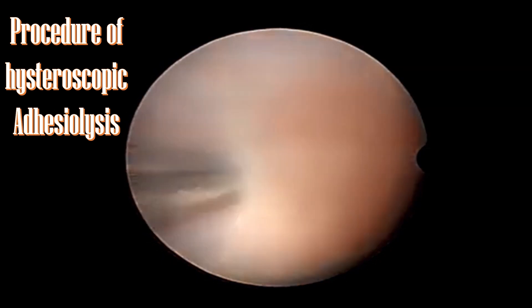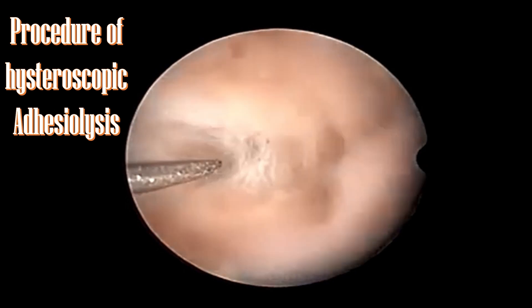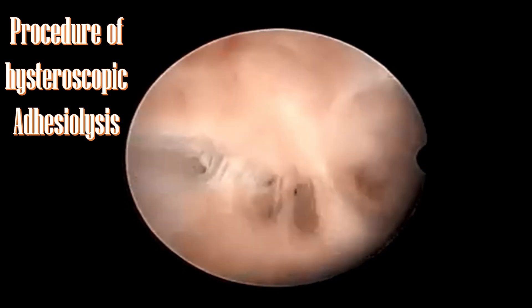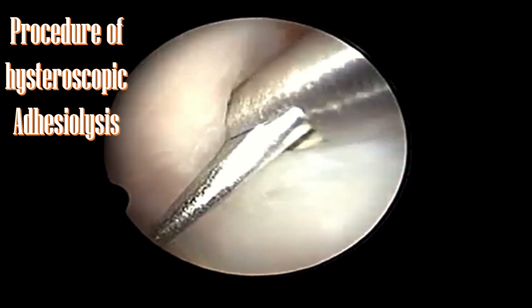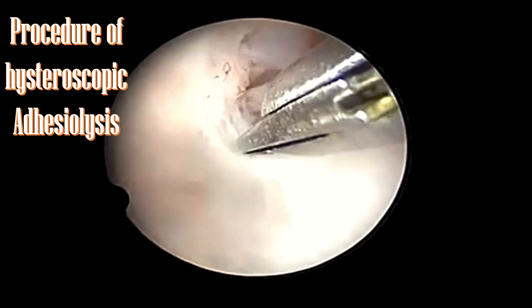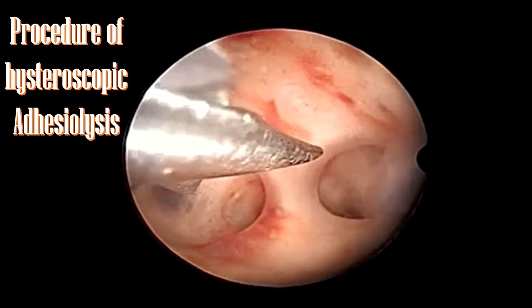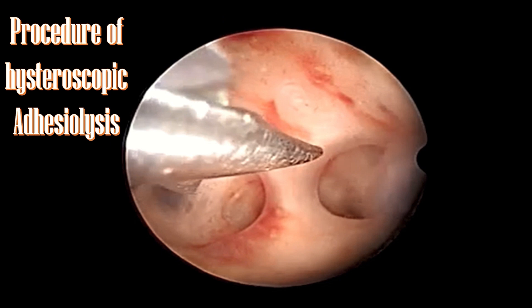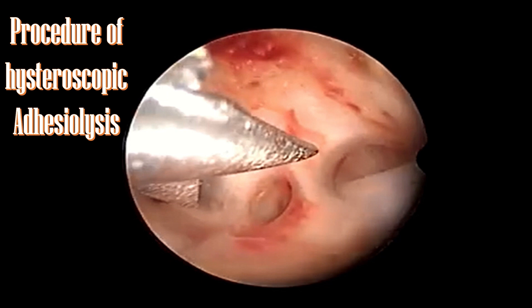In hysteroscopic adhesiolysis, specialized instruments such as scissors, graspers, or laser devices are used to remove the adhesions under direct visualization. Scar tissue is very carefully removed during this procedure, which aims to meticulously restore the normal anatomy and functionality of the uterus.